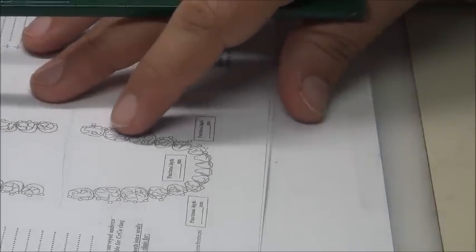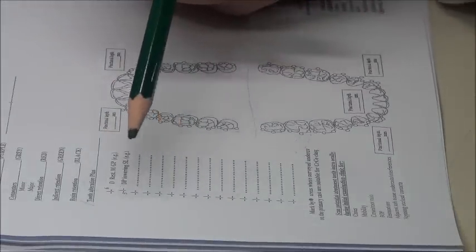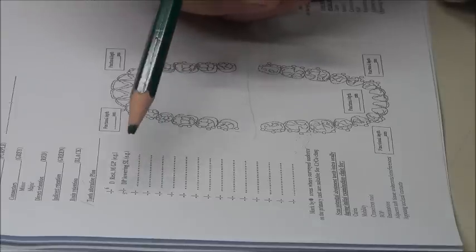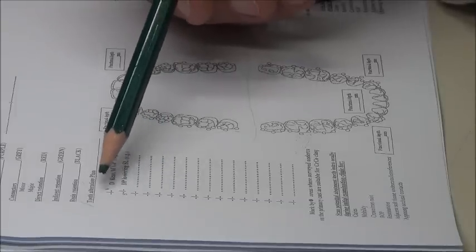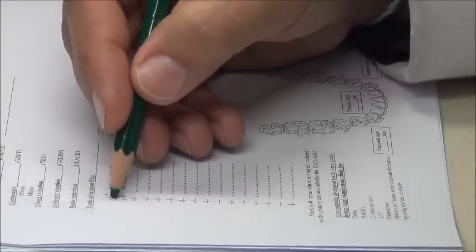You don't know what previous doctors have seen him. So you need to write for each tooth the preparations, and the examples are written here in the form. There are already some examples for the preparations. Notice that teeth have sometimes multiple preparations. Okay. For example, this is a case: distal rest, upper 6, upper right 6. Of course, this is designed in a way to have a cross. This is the cross in the middle.